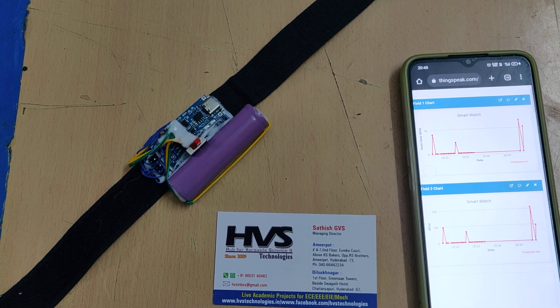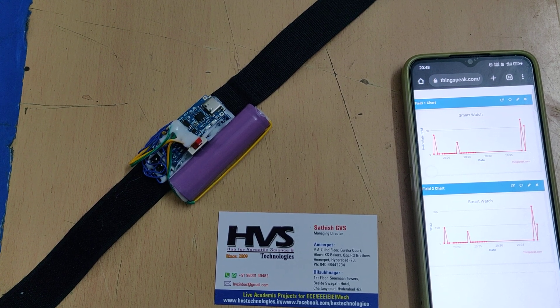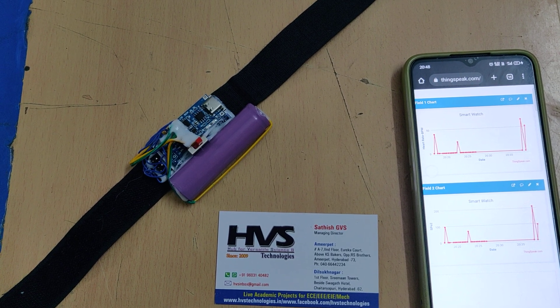Welcome to the project demonstration of IoT-based human health monitoring system using Arduino Nano. We are monitoring health parameters on the ThingSpeak cloud platform. This can be accessed from anywhere in the world, and the data will be stored until we erase it, with graphical presentation. The parameters we are monitoring are heartbeat in beats per minute and SPO2 in percentage.